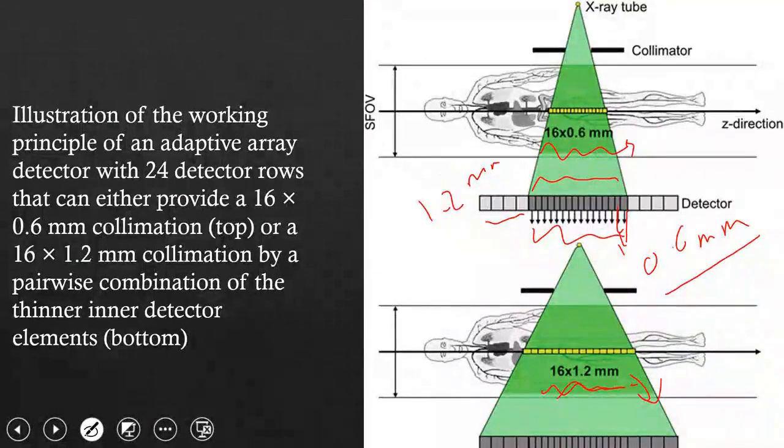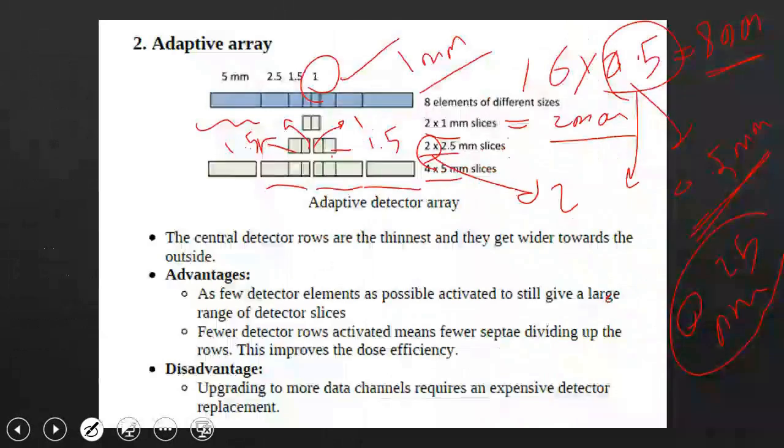All right, where is this? Okay, great. So, the question here is, what will he take this with? This goes back to the configuration of the detector itself, Dr. Hani. The configuration means the shape of it, which is crucial for its functionality and accuracy in detecting specific elements.